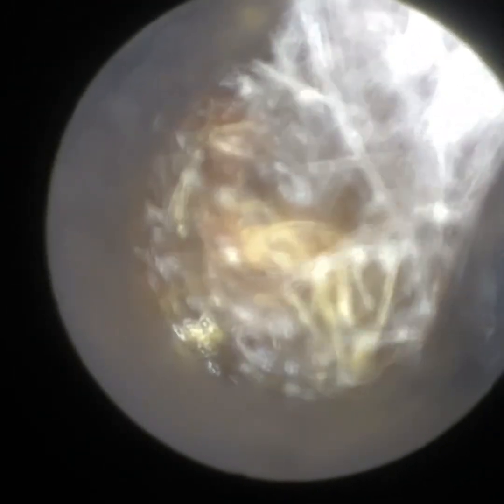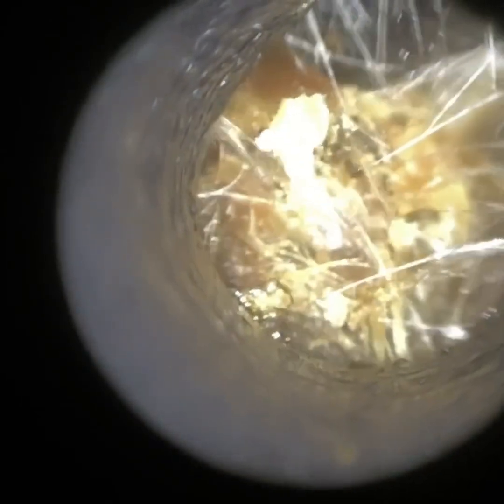On this side the wax was a lot drier — they hadn't been using any drops here, but the methodology would be the same. I'm going to have to use a hook straight away. I'm just going to go again to the roof of the ear canal, then rotating the hook, trying to get the tip into the core, and slowly come forwards.